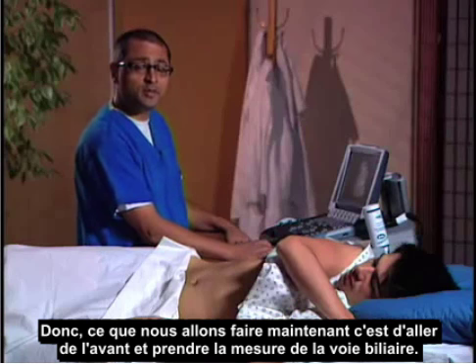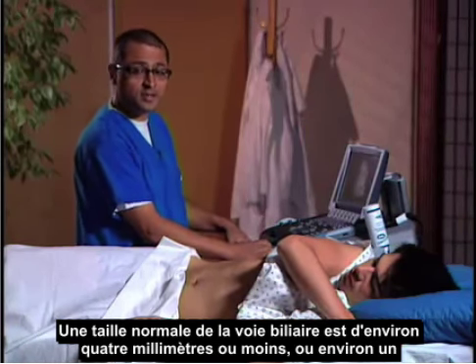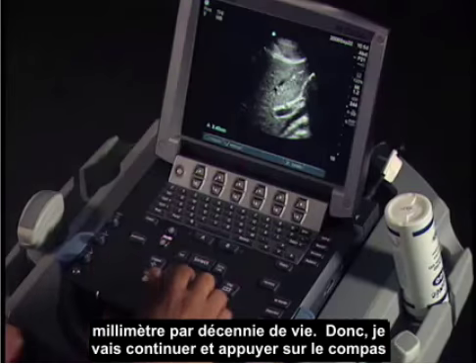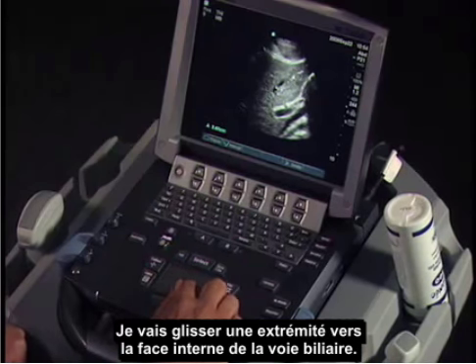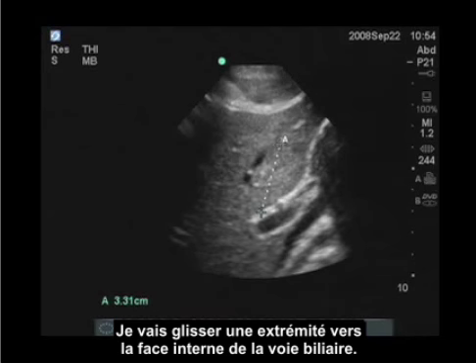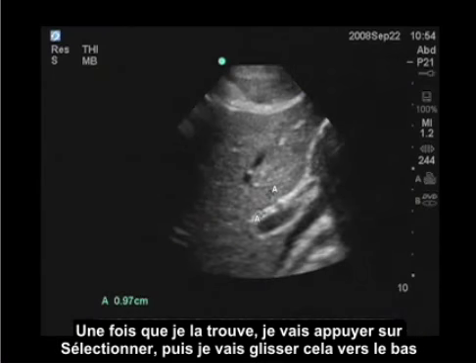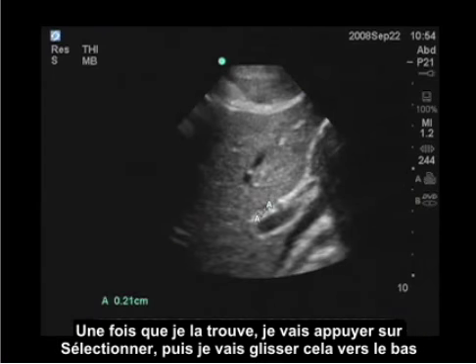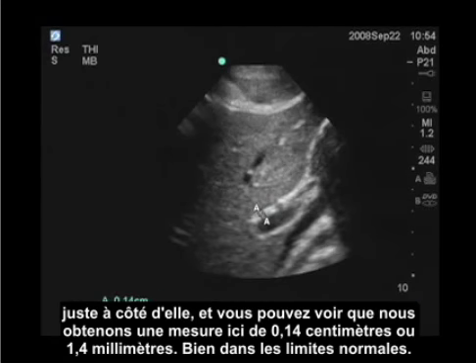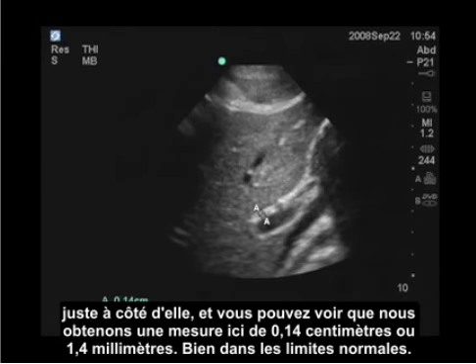What we're going to do now is go ahead and do the measurement of the bile duct. A normal bile duct measurement is about four millimeters or less, or about one millimeter per decade of life. I'm going to hit caliper and drag one end to the inner aspect of the bile duct, then drag the other end just adjacent to it. We're getting a measurement of 0.14 centimeters or 1.4 millimeters — well within the normal limits.